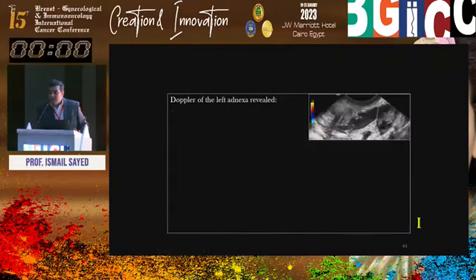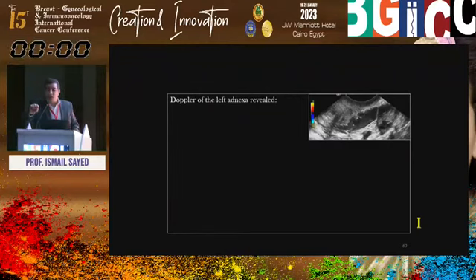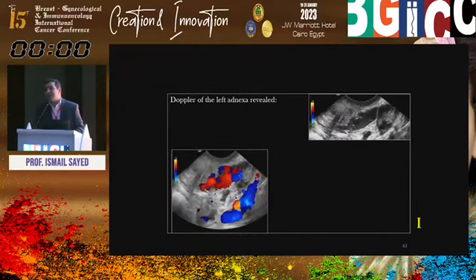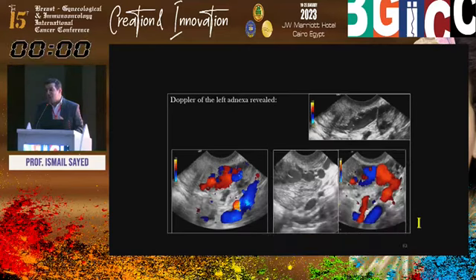What about the other side? Is this a fallopian tube? I'm putting Doppler, no color. Just a minute. What is the differential diagnosis of a dilated tubular structure? Pelvic varices. But pelvic varices have very slow flow. Ask the patient to Valsalva. Now it's pelvic varices.